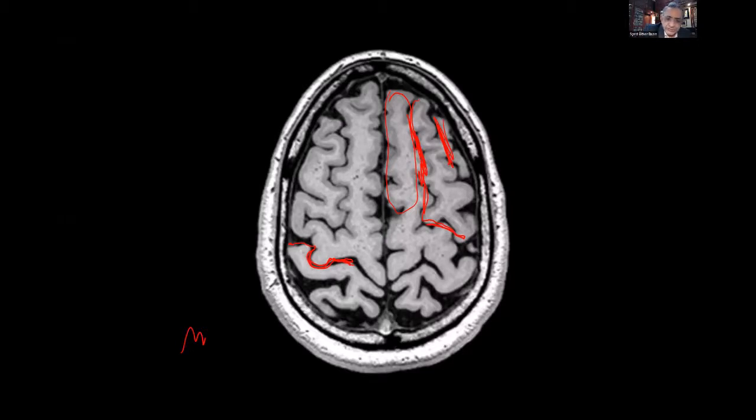The other thing that one sees is the pars marginalis, which is coming from the medial side as part of the cingulate sulcus. It goes up and it gives you this thing. Right anterior to that is the central sulcus. So that will help you localize.